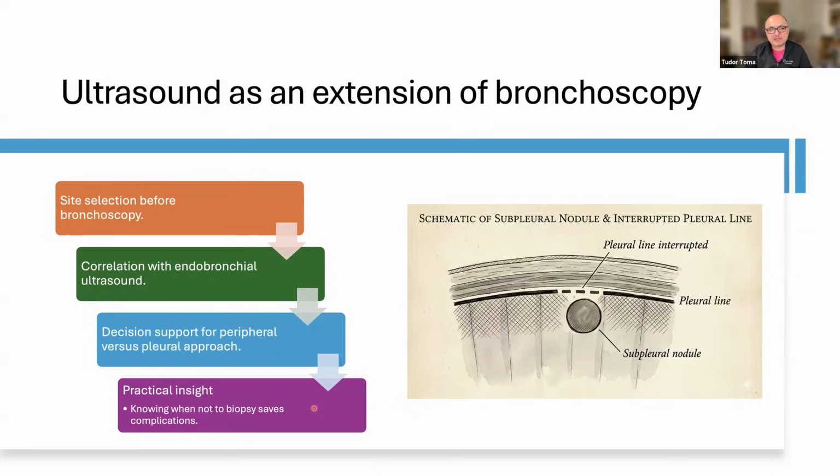The correlation with the endobronchial ultrasound, yeah, it may be helpful. I mean, it depends on what the pathology is. I think the main additional benefit is to say when the endobronchial biopsy is not necessary.